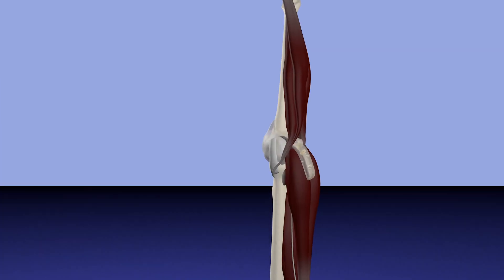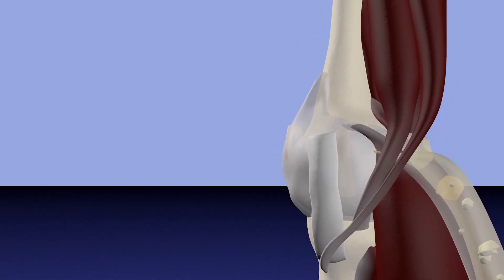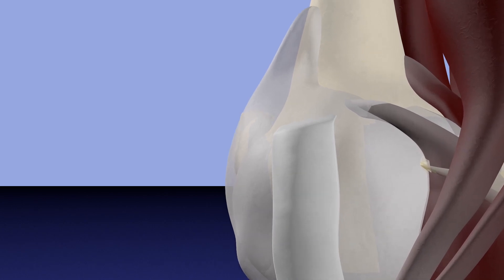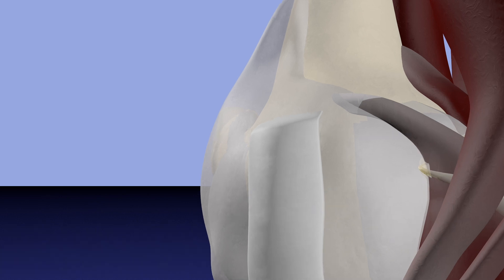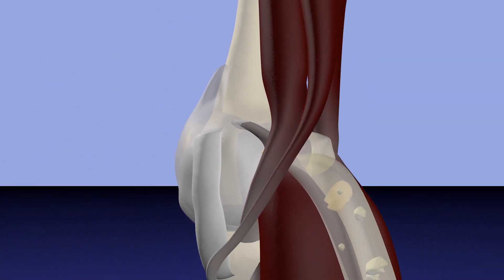Here's some of the anatomy that we're going to be focusing on during this procedure. We can see a fairly sizable Baker's cyst overhanging the medial gastrocnemius muscle. And here we're trying to focus on that little communication track that is between the medial gastrocnemius tendon as well as the semimembranosus tendon.